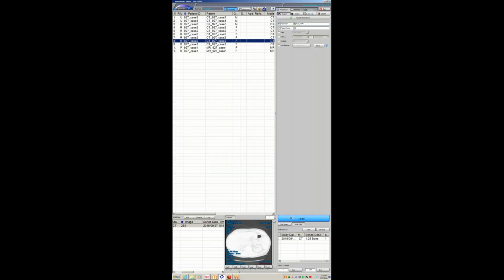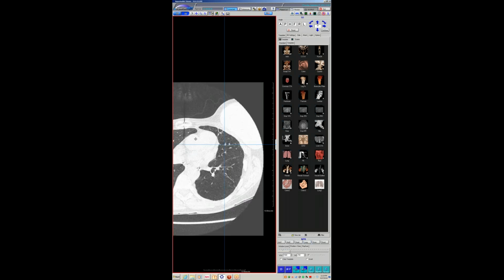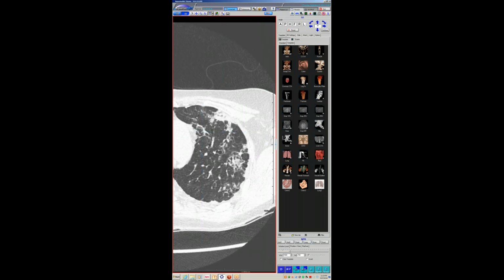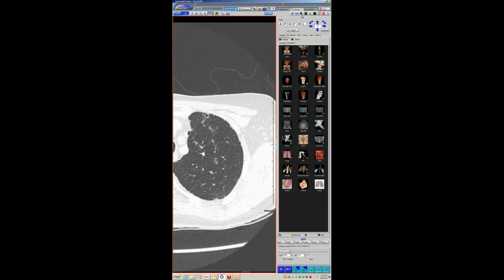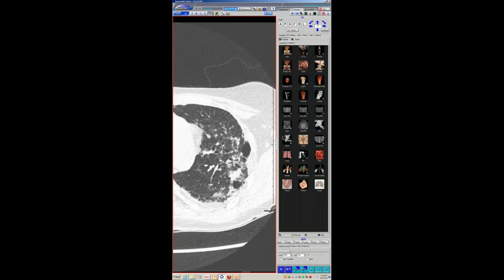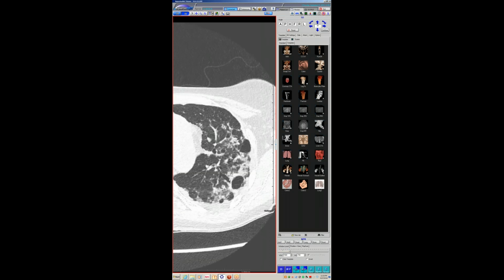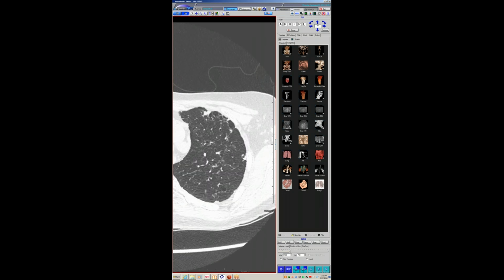Yeah, I agree. The older study he was showing, I agree, it looks weird with all that peribronchovascular stuff. Yeah, I mean, the more recent one, sarcoid. I totally agree, and I agree with David that nobody would call this PPFE. I think the more recent one that you showed was more confluent in the upper lobe.